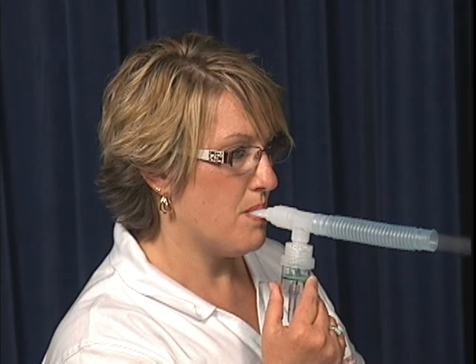As the medication is administered and the level drops in the medication cup, the cup may need to be tapped to deliver all of the medication during the breathing treatment. Finally, reassess the patient and provide supplemental oxygen.